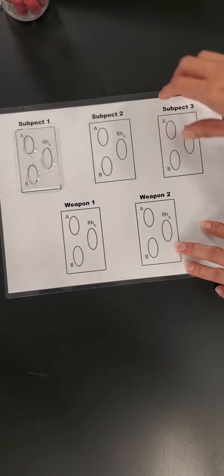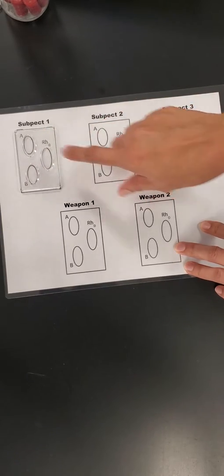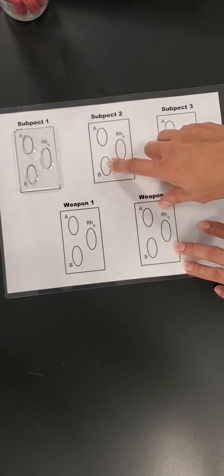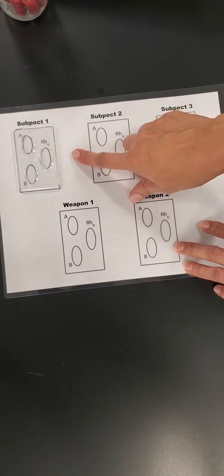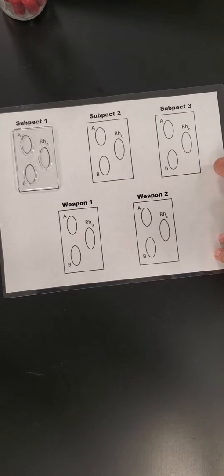And then in your data table, you're going to make notation on whether any agglutination happened in any of them. If there is, then you put a positive. If there is not, then you put a negative. So that's basically the rundown of the lab.